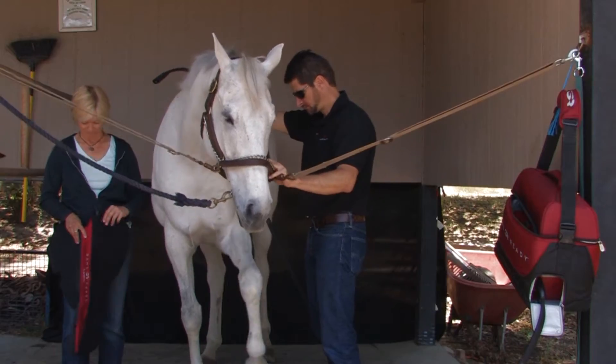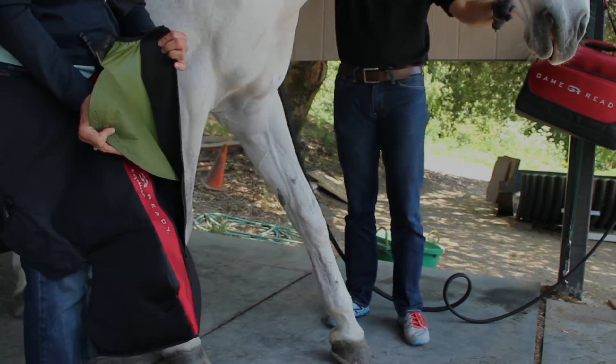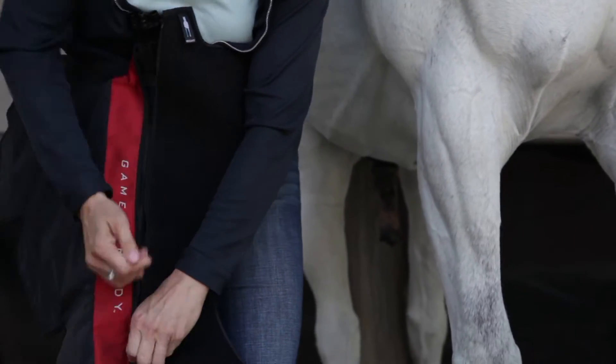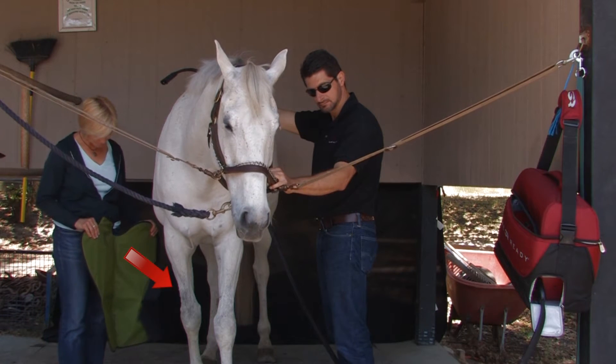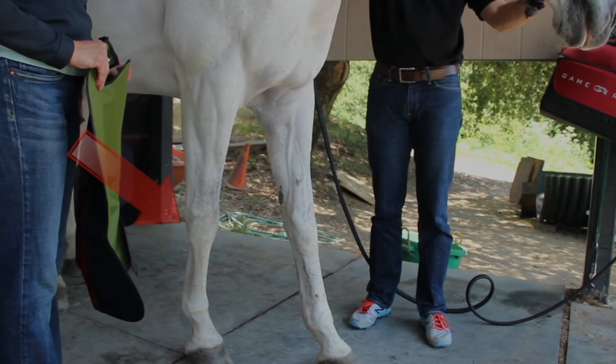The wrap is comprised of an inner two-chamber heat exchanger and removable, replaceable sleeve that facilitates the delivery of active compression and cooling to the injury or surgery site. The Equine Full Leg Wrap can be used on both front and back legs. Choose from right or left specific options.